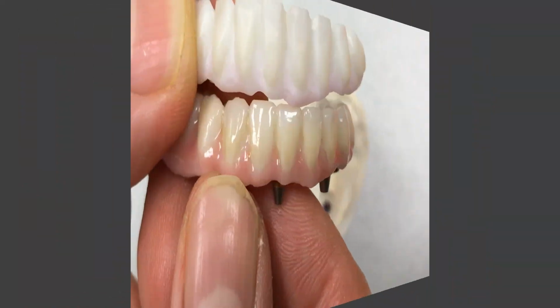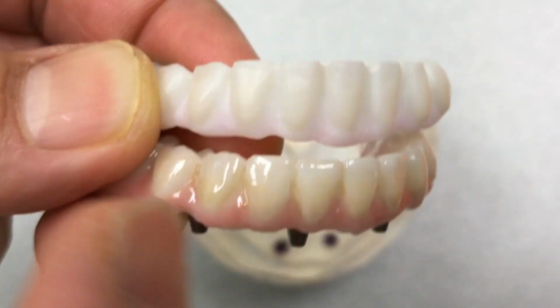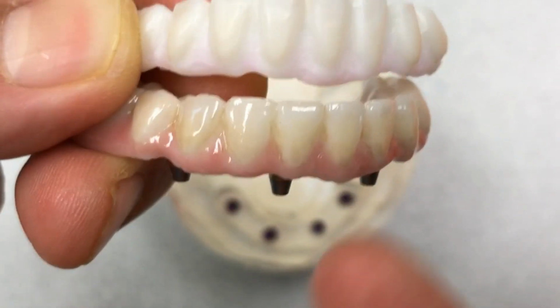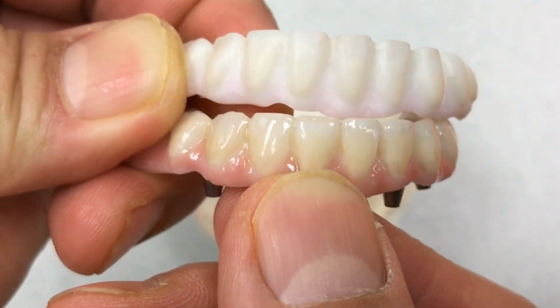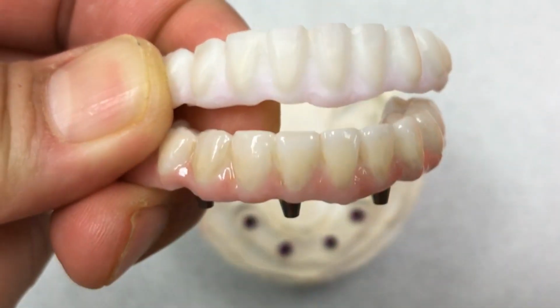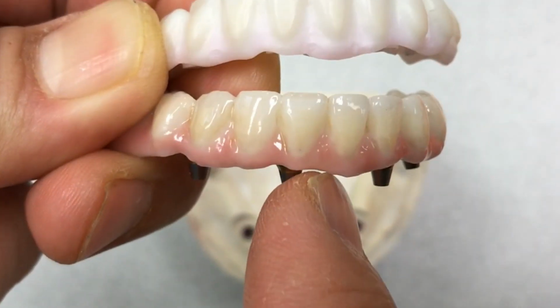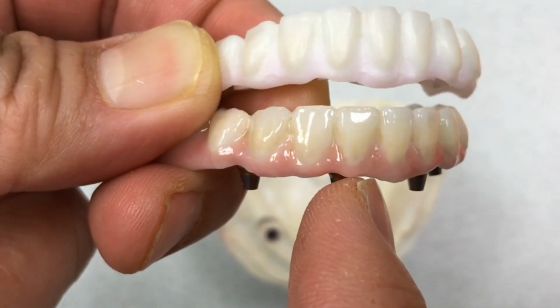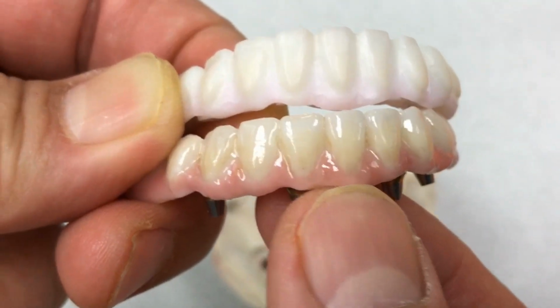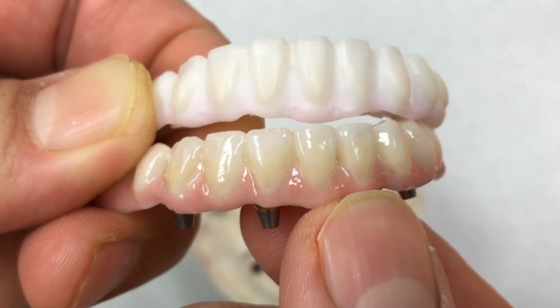Good. Full mouth zirconia, that is behind the scene, which is we made the frame design and slightly cut back facially. We apply the porcelain and then make it as natural as much as possible. Not only that, you see our pink color differentiation. So we added, remember yesterday, last week, you videotaped about how to build up my porcelain here and gingiva. So that was the final scene.